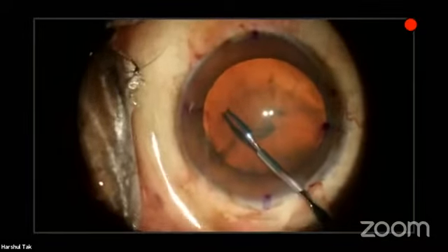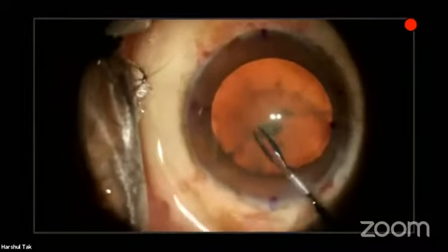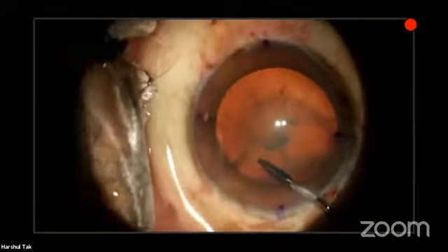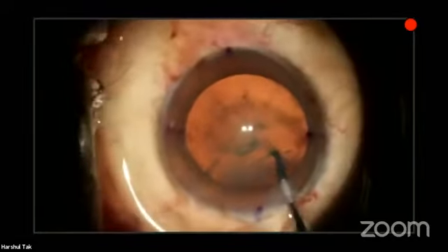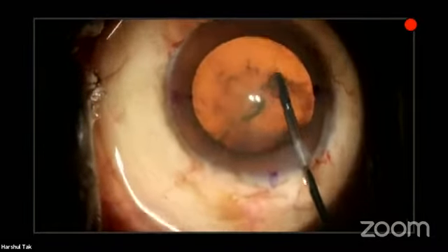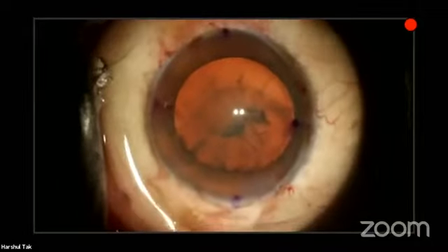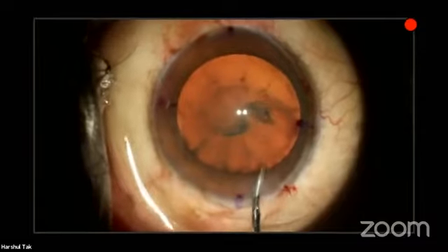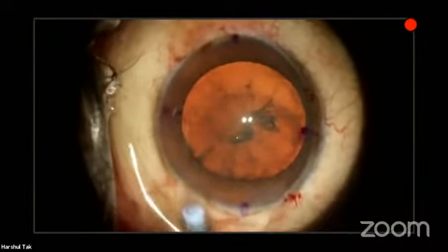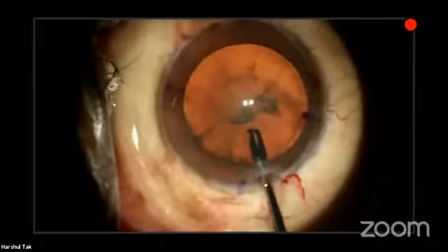The micro capsulorhexis forceps. Visco, please. So again, you need to go and put visco so that you don't lose the depth of the chamber while coming to the last part of the capsulorhexis.